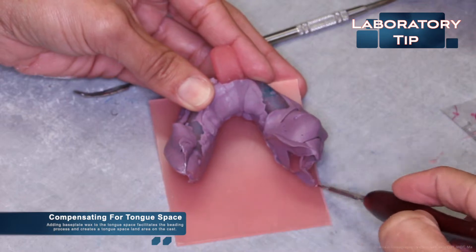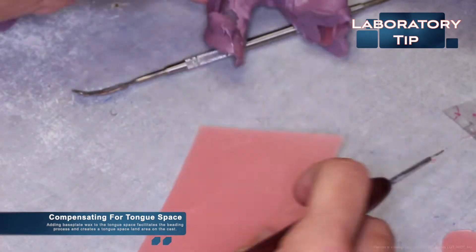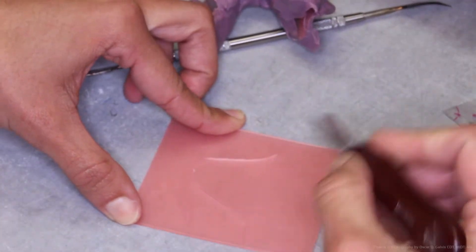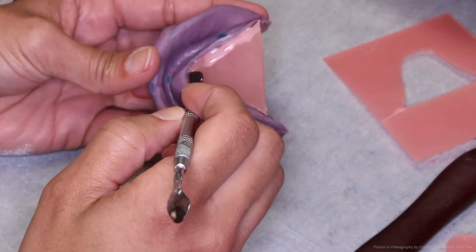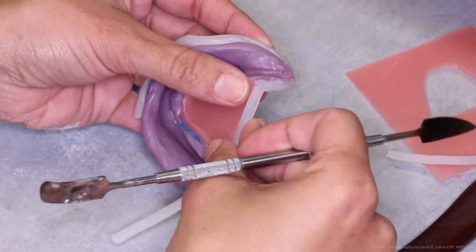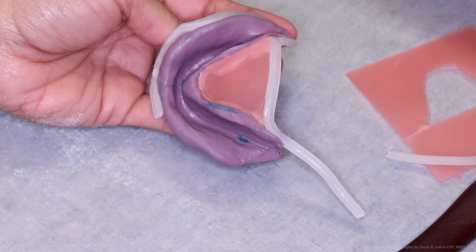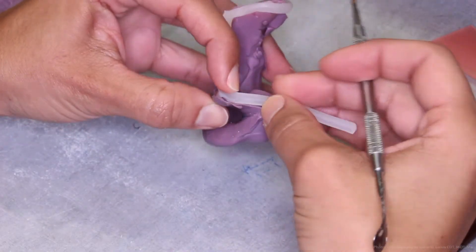When beading a mandibular final impression, it's a good idea to compensate for the tongue space. By adding baseplate wax to the tongue space, it facilitates the beading process and creates a tongue space land area on the cast. The piece of baseplate wax that has been cut is applied to the tongue space and sealed. Once it's sealed firmly, the utility wax can be roped along its edge. This is much easier than trying to adapt the utility wax along the tongue space.